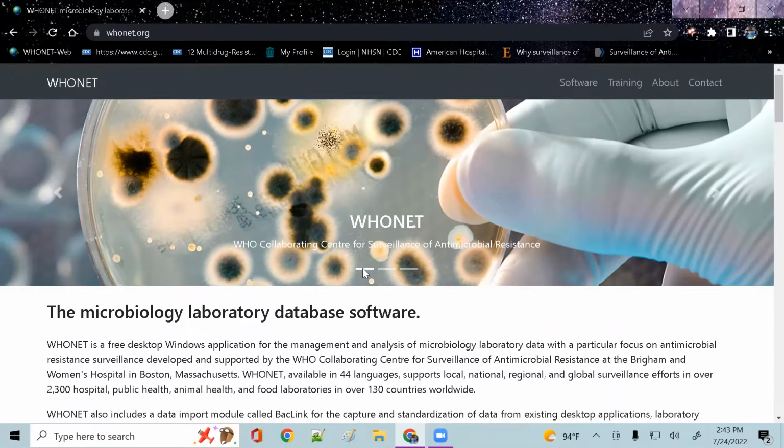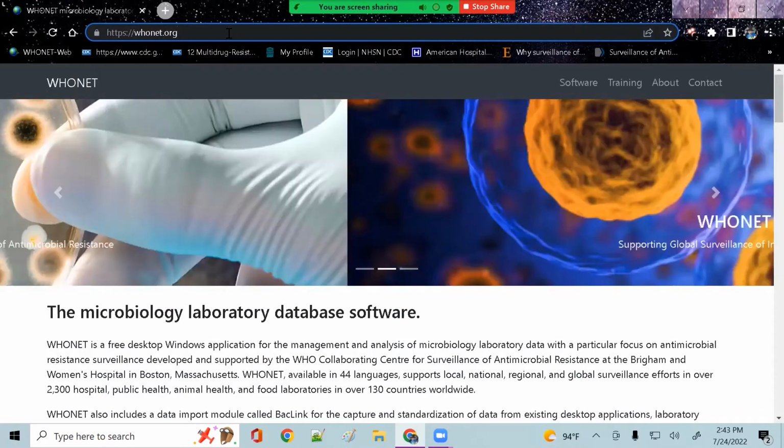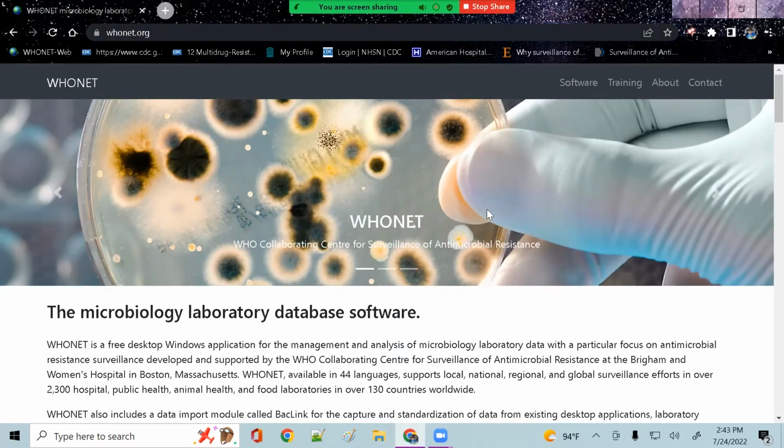To find our website, open up Google Chrome, Microsoft Edge, or Firefox, and navigate to https://whonet.org. You'll see our website that looks like this.